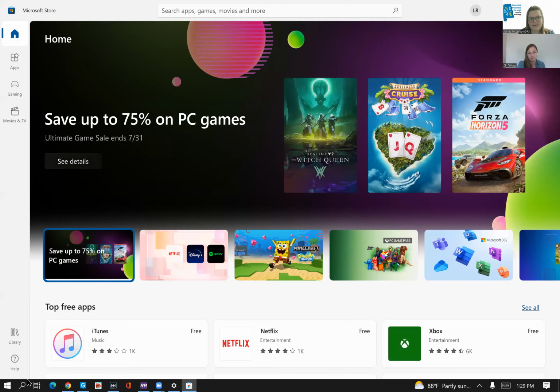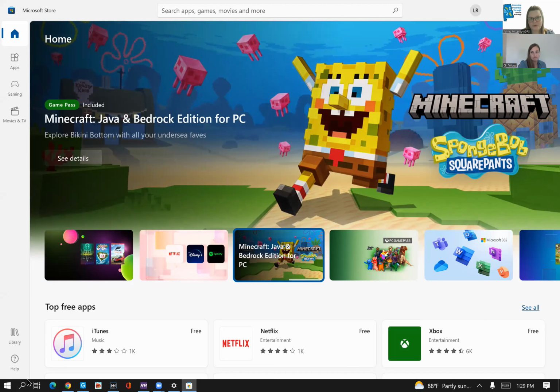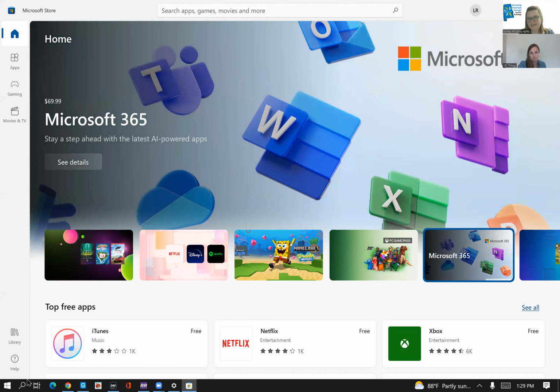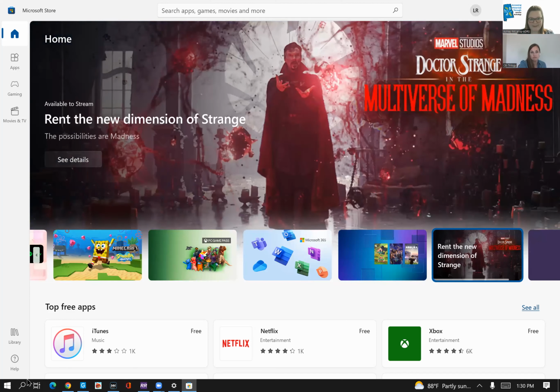And so what I showed is an option when there may not be an app in your app store that the device developer has made to control your device through the internet. What I showed was a portal where you go to the website and log in, and you can control your device. What Lane is showing you is an actual application, like what you would download on your iOS device if you go to the Apple App Store. However, this would be the Microsoft Store for their devices, and it basically serves as a remote for your device through the internet.